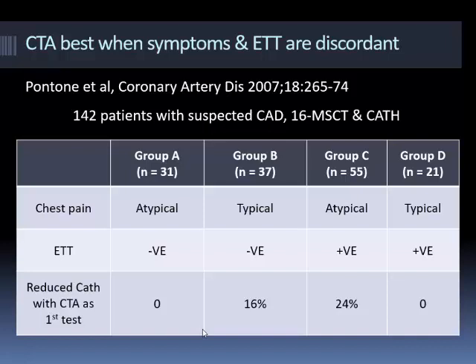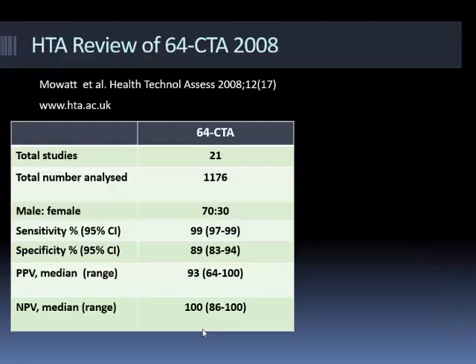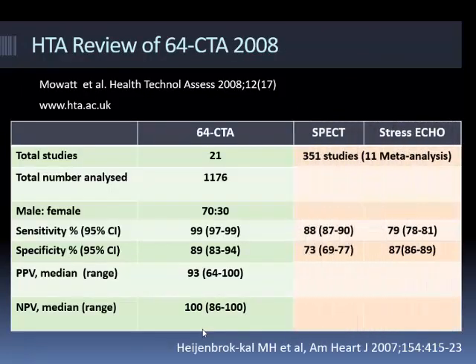I'll show you some data from the SCOT trial, which shows you how you can use CT angiography in the real world. This shows that compared to the traditional modalities that we're more comfortable with, SPECT and stress echo, CT angiography doesn't perform any worse.